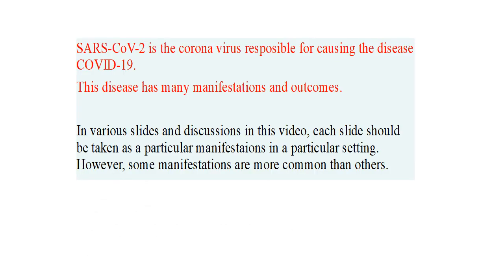SARS-CoV-2 is the coronavirus responsible for causing the disease COVID-19. This disease has many manifestations and outcomes. In various slides and discussions in this video, each slide should be taken as a particular manifestation in a particular setting. However, some manifestations are more common than others.